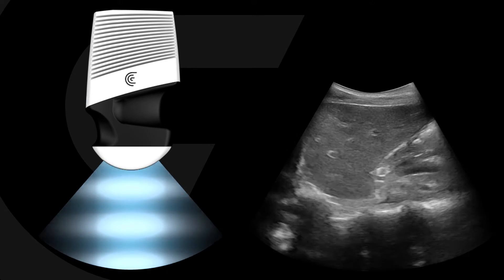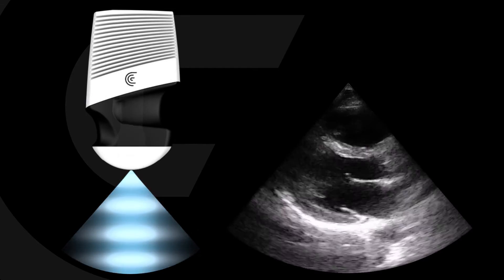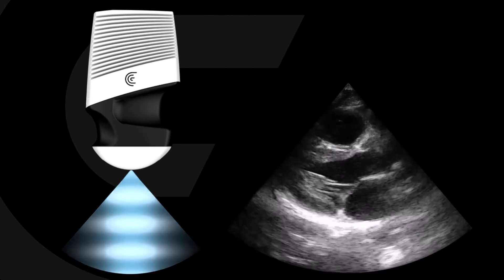The Clarius C3 scanner was purposely designed for convex and sector imaging using a patent-pending virtual phased array technology. We've also made sure to maintain excellent image quality and high frame rates with both imaging modes.